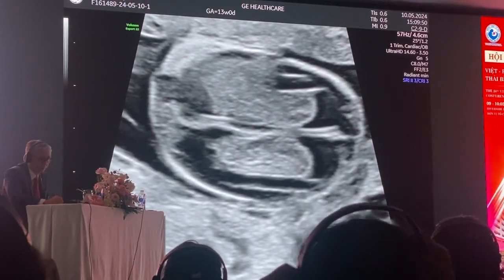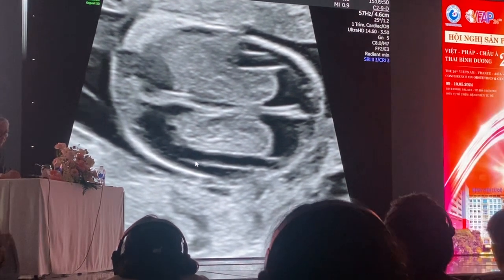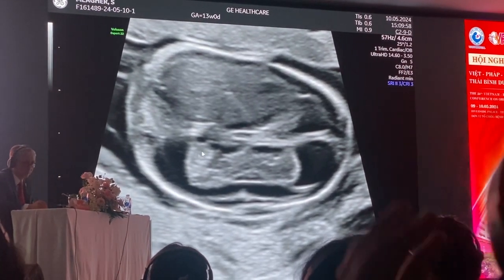This is the lateral ventricles. So this is the fluid inside the lateral ventricles here, and this here is the cerebral cortex. So cortex, fluid, and then this is coming down. This is the cavum velum interpositum, which is just here.